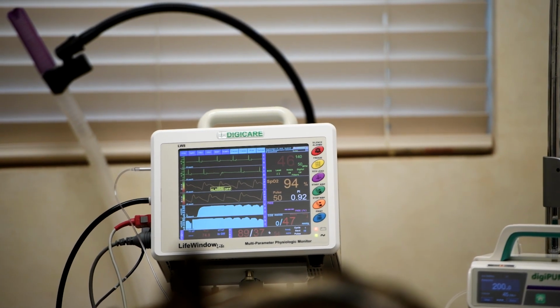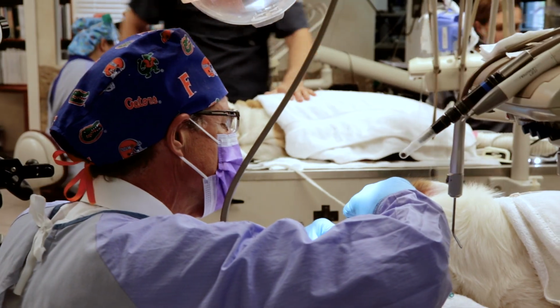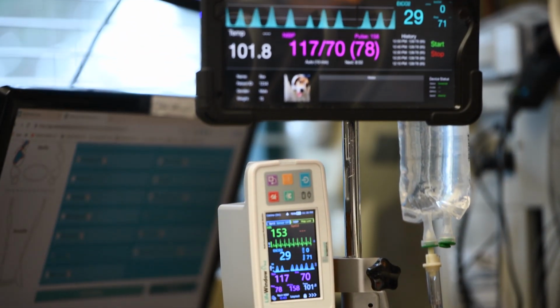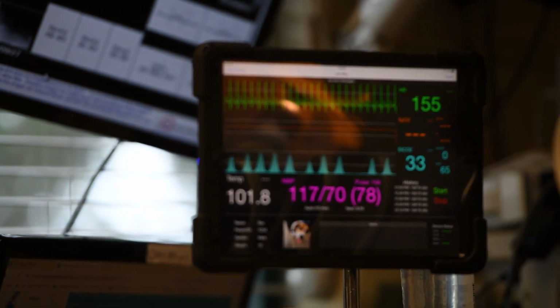And there are 3 parts to it. There's picking the right patient, making sure that you know what's going on, blood work and x-rays and EKG. Then picking the right anesthesia, which is, each case is a little bit different, whether they're old or young or what stage of anesthetic risk they are. And then most importantly, the monitoring. A lot of folks don't pay attention to the monitoring after the anesthetic is over, but research has shown that the majority of adverse events happen to dogs and cats in the immediate 20 minutes after anesthesia. So monitoring really, really helps.